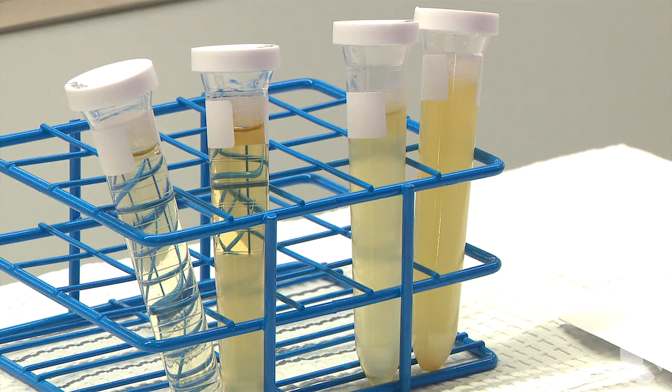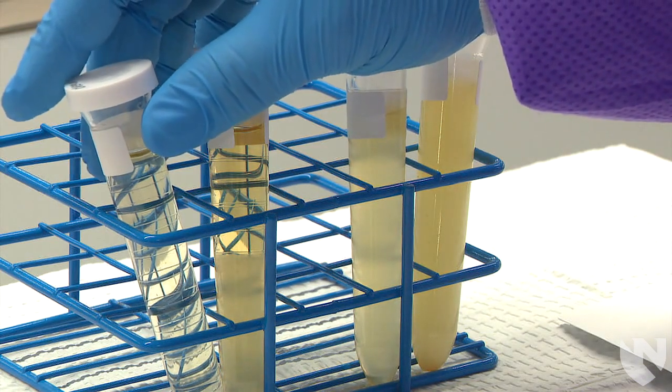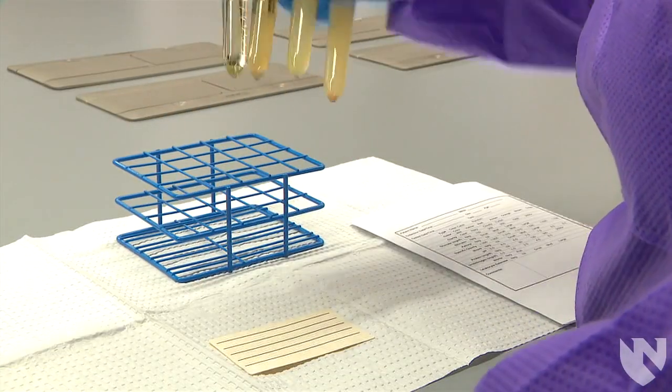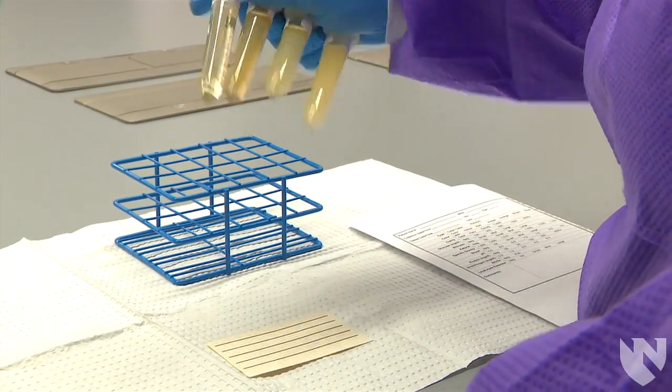The first part of a routine urinalysis involves an assessment of the physical properties, color and clarity. This video will demonstrate how to examine the clarity of urine. The specimen for this test is fresh, uncentrifuged urine in a conical test tube. We will begin by inverting the urine several times to mix it.